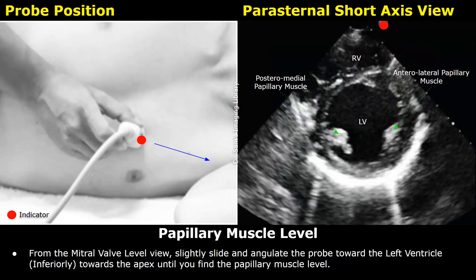From the mitral valve view, slightly slide and angulate the probe downwards towards the apex until you see the papillary muscle level. Inside the left ventricle, these structures are the papillary muscles. The anterolateral papillary muscle is seen on the right side and the posteromedial papillary muscle is on the left side in this view.